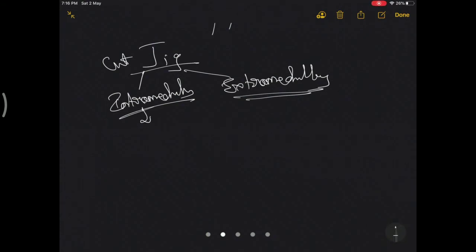Mostly we will use an extramedullary jig for the tibia, and an intramedullary jig for the femur, because in the femur, using an extramedullary is difficult. You have an exposed ankle, a palpable anterior crest, and a shin which you can align with the jig, whereas a bulky thigh will not let you know where the femur is or where the center of the head is.